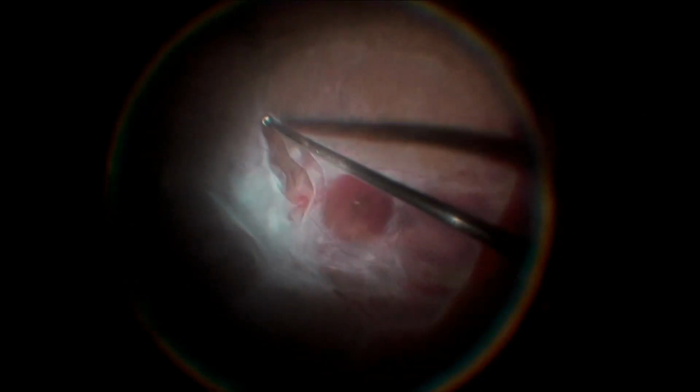Again, we see the technique of inside-out membrane dissection. Forceps and cutter both are used for segmentation. Finding the right plane of dissection is very important. We can see the cutter being used as a spatula to lift the membranes and also to cut them.